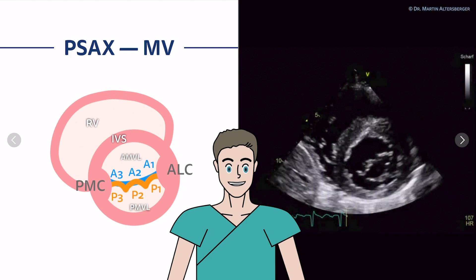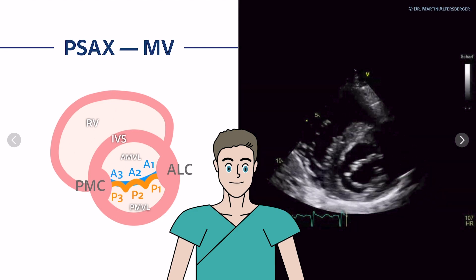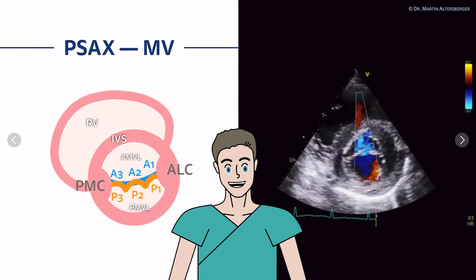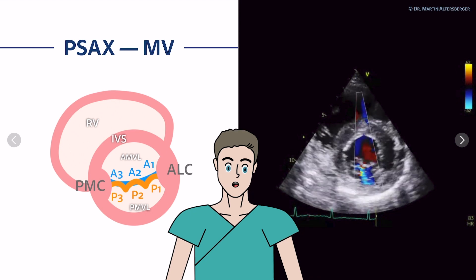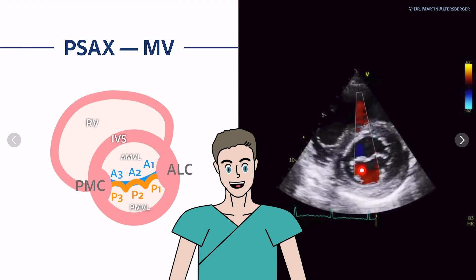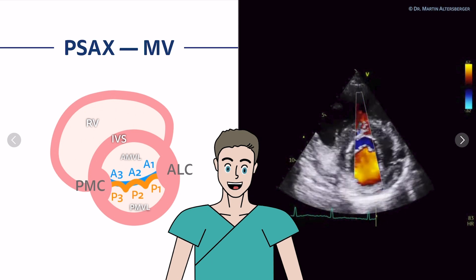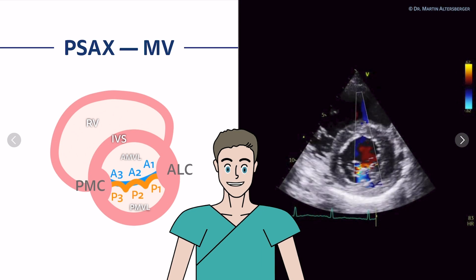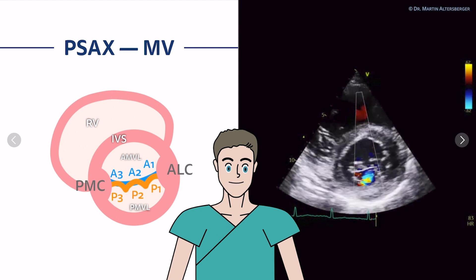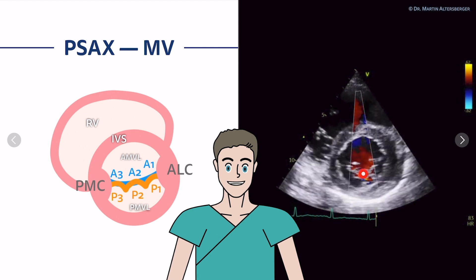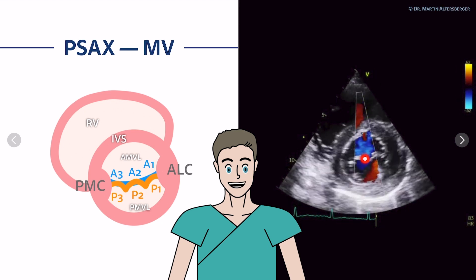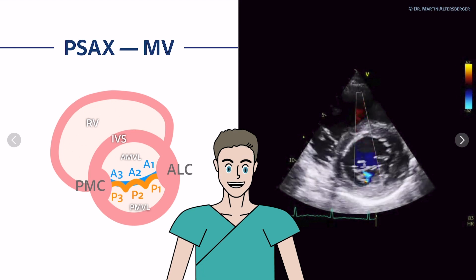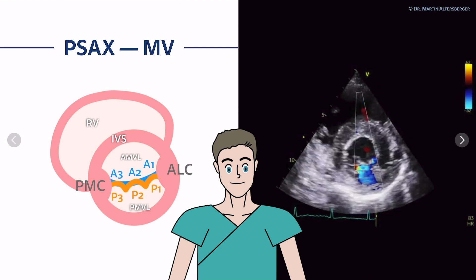The mitral valve looks a bit off, but we need to add color Doppler information. With color Doppler, we can see that there is truly a problem with the mitral valve — mitral regurgitation. There is turbulent flow and a regurgitant jet that you can already appreciate in this view. Most importantly, in this specific view, you can see that the origin of the jet is in the P2 segment most likely. This is P2, this is A2, here we have P3, P1, and here in the center of the valve the regurgitation jet, which is eccentric, is present.